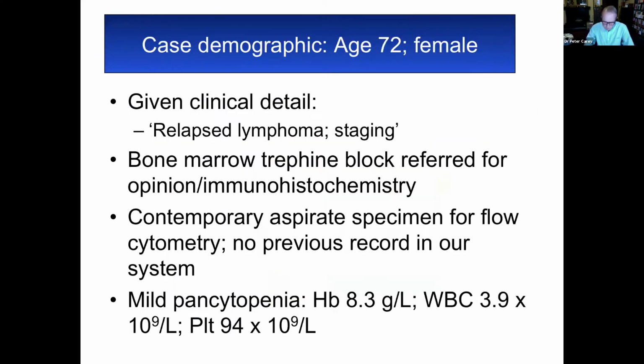So I'm going to tell you about a 72-year-old lady in the order in which I came across her material, and you'll see why, I hope, to make the point later. And it wasn't that we got no clinical detail, we got minimal clinical detail. We got relapsed lymphoma staging.